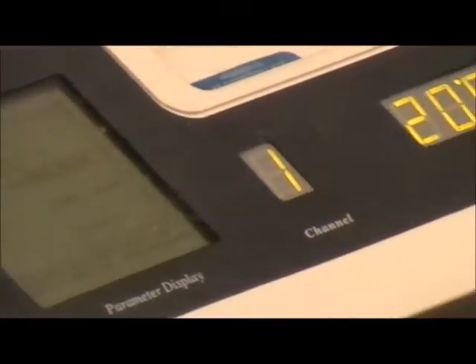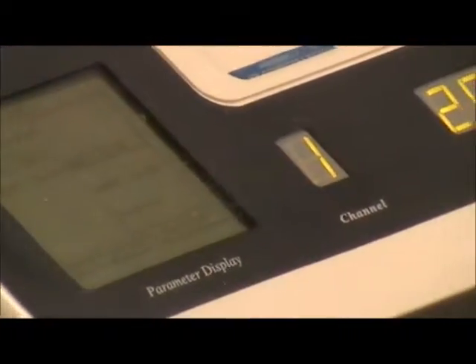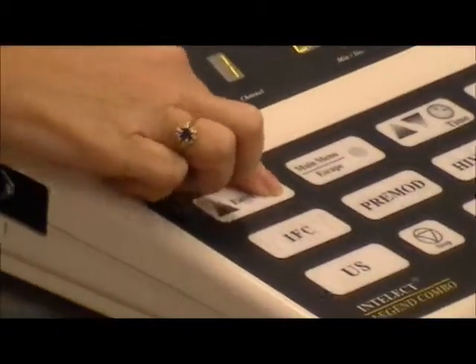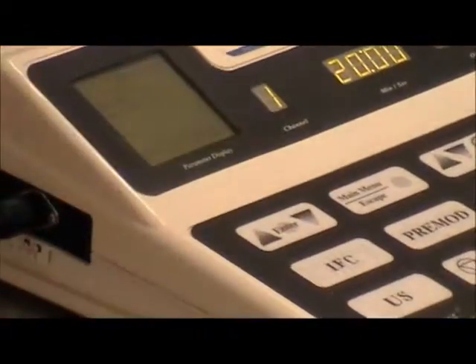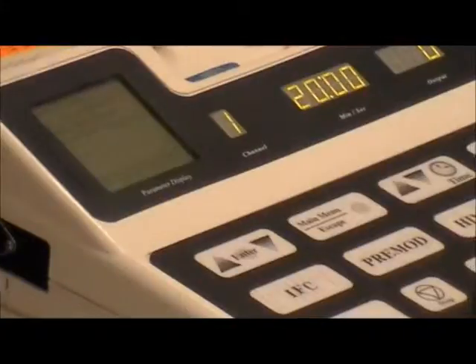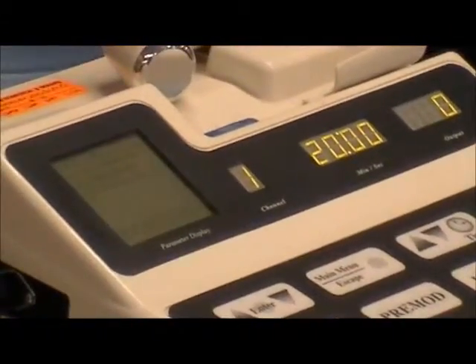100% scan scans the whole area between your pads. Static does not scan. So static is quadrupolar, as we refer to, it's pinpoint, okay? So you choose, move your box down to whatever you're doing, hit enter, and it will keep that if it's not what you want, okay? Wherever the box is around, that's what's being activated.